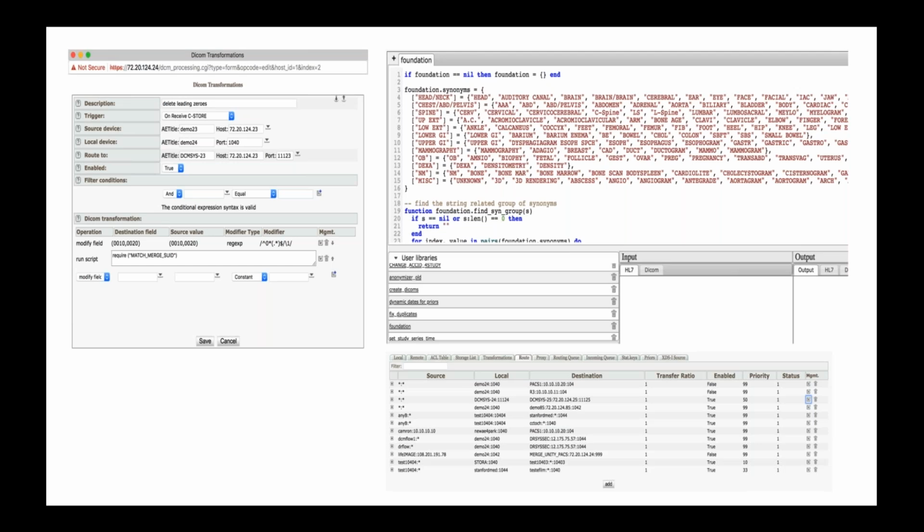If you're looking at an MRI of the brain, it would be very irrelevant to look at an X-ray of the knee that the patient had 5 years ago. It's not something that you need to be looking at. So, Chris, how did we create this with your physicians?